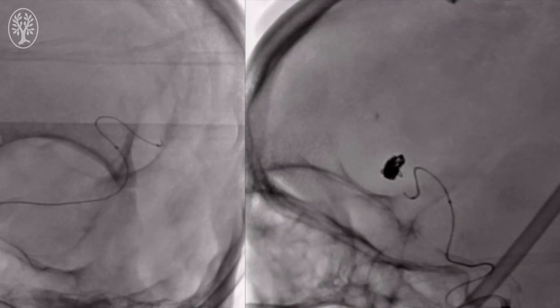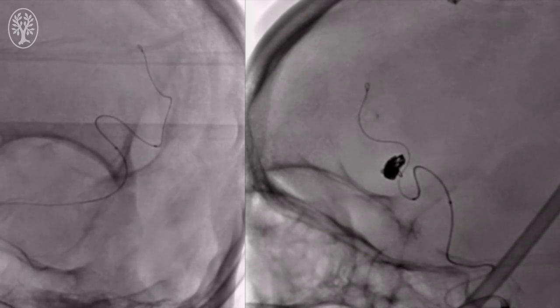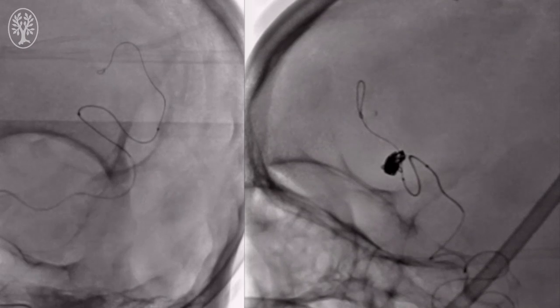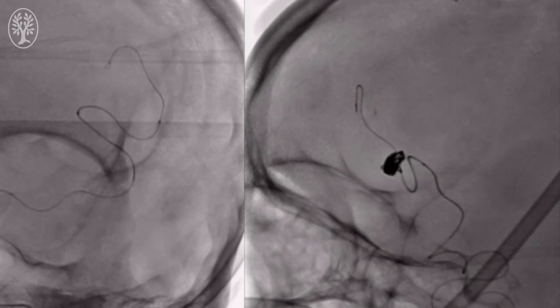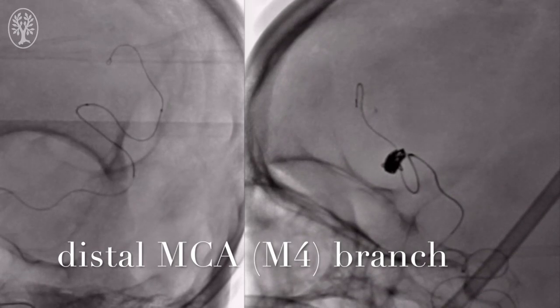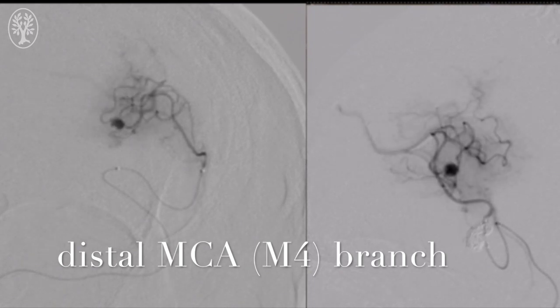Now we will attempt to get even closer to this mycotic aneurysm by bringing the microwire and microcatheter up distally using a J configuration of the wire. Here we can see that we brought the wire very close to the origin of the mycotic aneurysm. Now we will begin to track the microcatheter over the wire using push-pull techniques, often shutting the flush off to get the catheter into the distal M4 region.